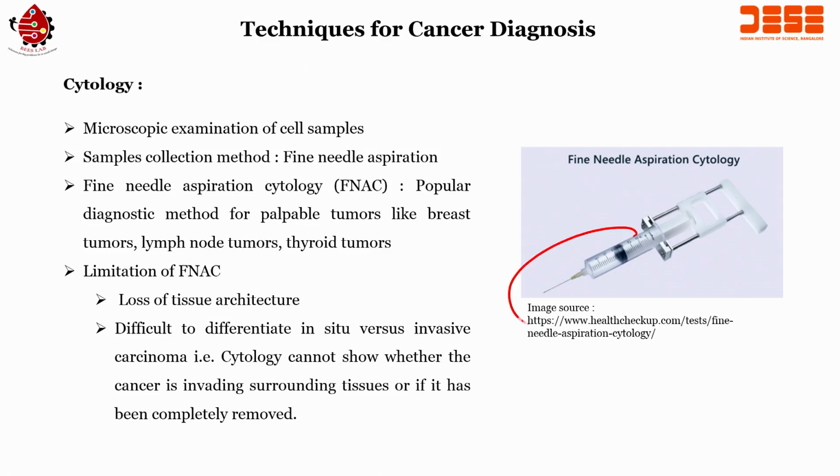Okay. This is where we want to take the cells from the suspected region in a breast cancer case or thyroid tumors or lymph node tumors, but when we talk about oral cancer then we can just use a biopsy. I will show you what exactly a biopsy means.